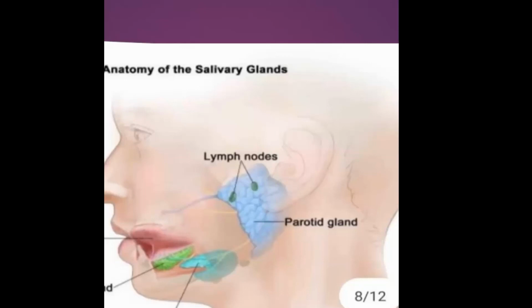But for a malignant lymph node, you see that they begin to lose that oval shape and become roundish. And for the ones that are necrotic, you won't even see blood flow, internal flow, in them. I'm sure they are very common here because of TB. Sometimes you see them more in level 4 too. Level 4 and supraclavicular lymph nodes.